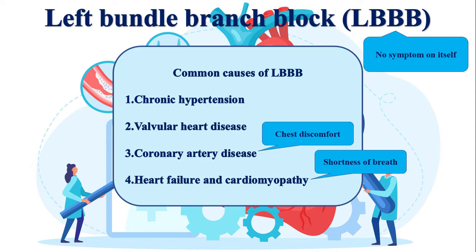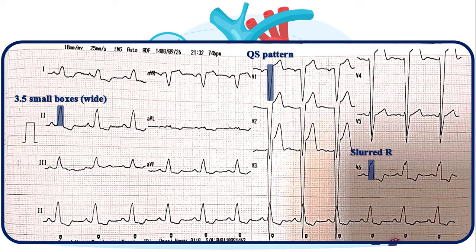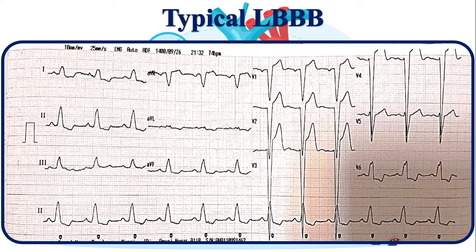Let's go through several examples. In this first example, the duration of QRS complexes is about 3.5 small squares. There is a QS pattern in V1, with a slurred R-wave in V6. Thereby, this strip demonstrates typical left bundle branch block. Also note the absence of septal Q-wave, discordant ST segment elevations in V1 to V4, and discordant ST depressions in inferior and lateral leads, all attributable to LBBB.